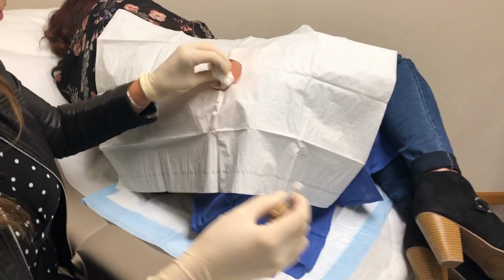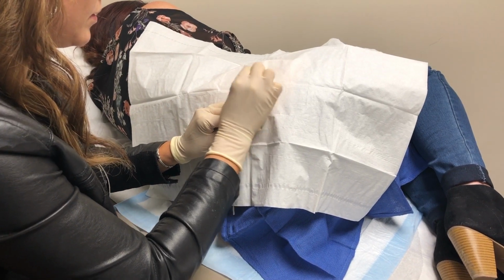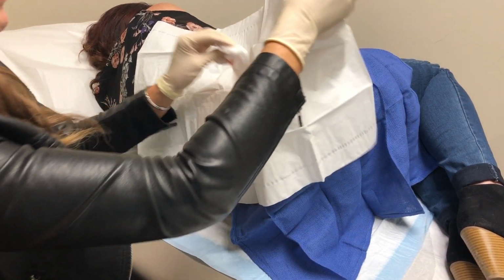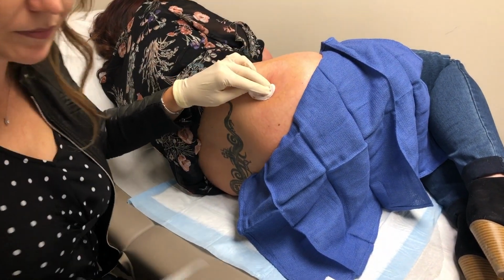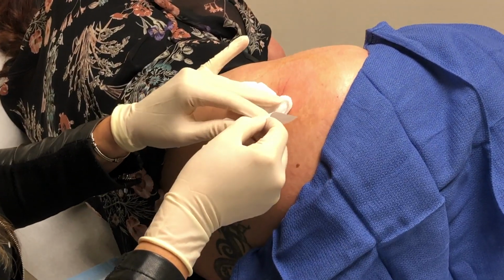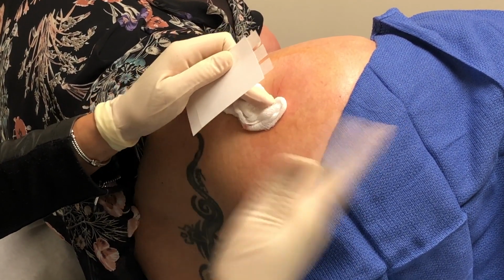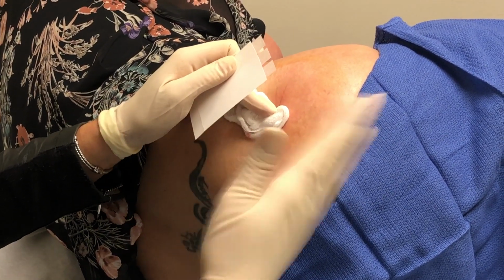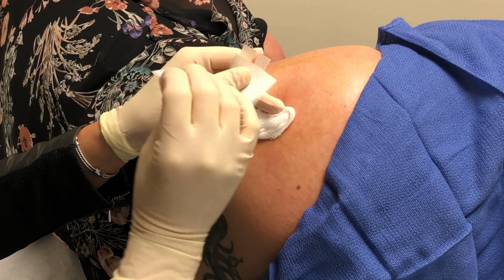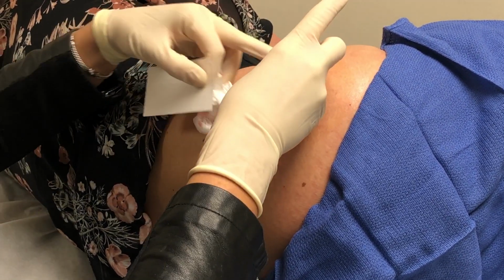I'm just going to take some steri strips. I'm going to pull this off. We'll just close this with just some tape. It doesn't even need a stitch. The wound is so tiny. We like these steri strips to stay on for 3 to 5 days. And then that wound just comes together all on its own.